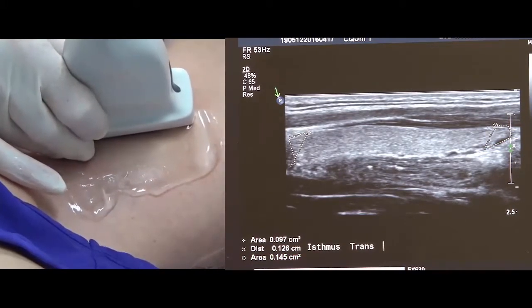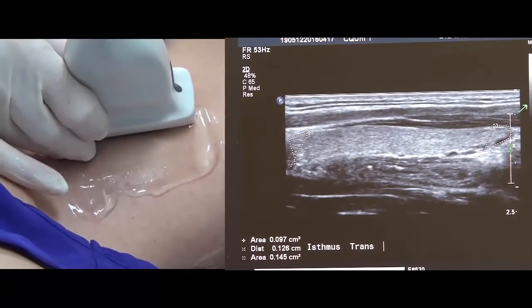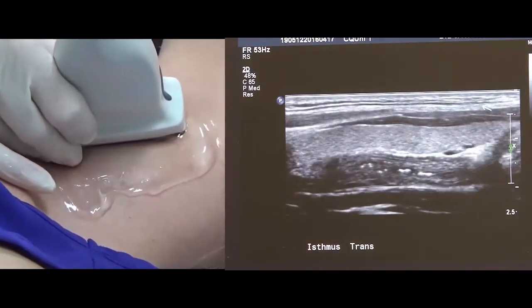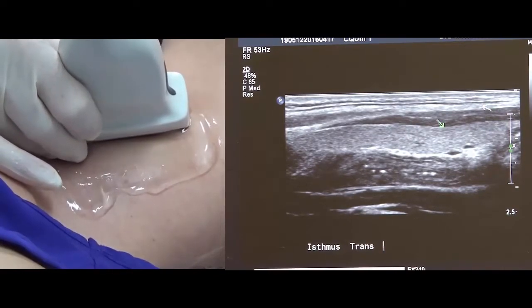So this is to the head, this is the superior portion, so superior anterior portion, superior posterior portion. This is the inferior portion towards the feet. So they are showing you where the edges are. Students do find it a little bit tricky to actually see where the thyroid starts and finishes. So hopefully that helps you with my little ducktail analogy.